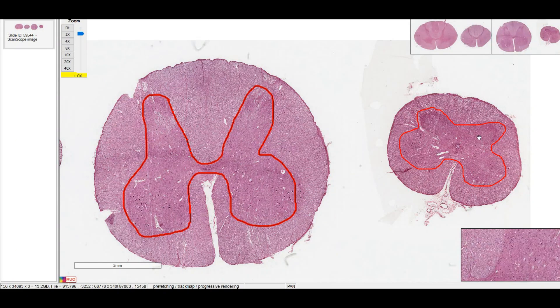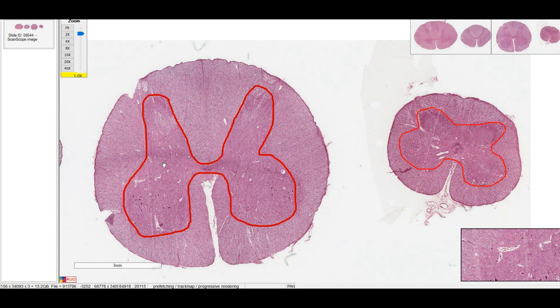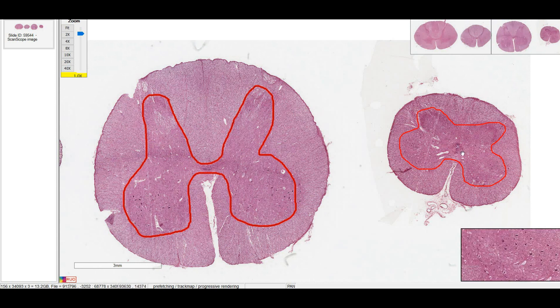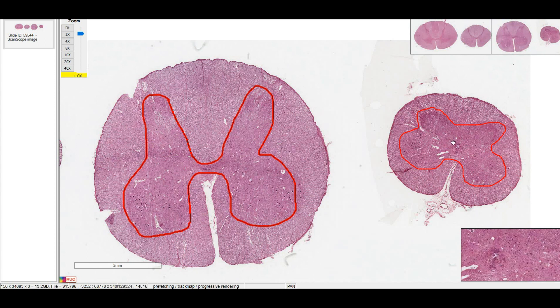If we look at the lumbar spinal cord versus the sacral spinal cord, we can see that there's a much higher ratio of gray matter to white matter compared to the thoracic or cervical. And comparing lumbar versus sacral, that ratio of gray to white is even higher in the sacral spinal cord. And in the sacral spinal cord, there's just a very small cross section in general.